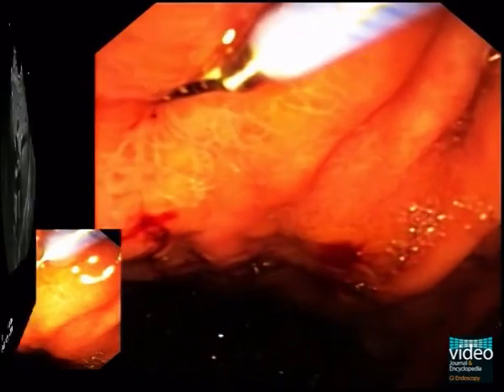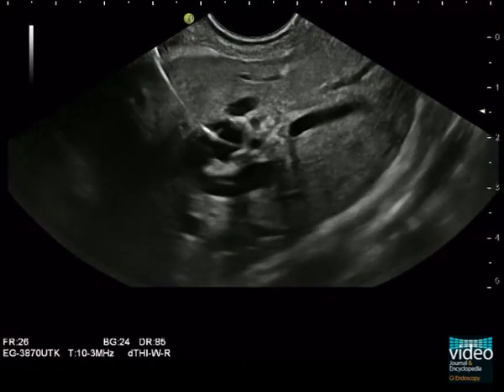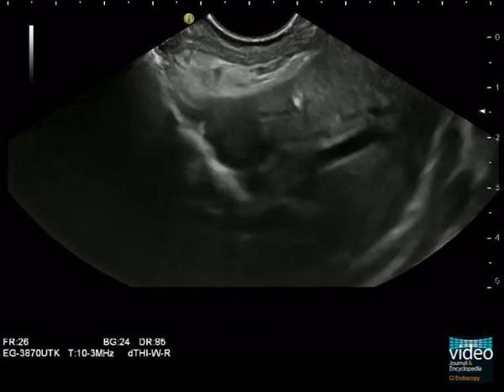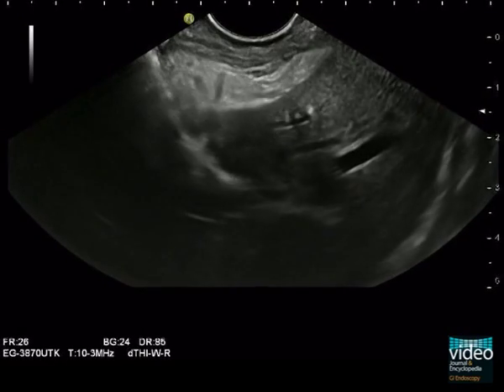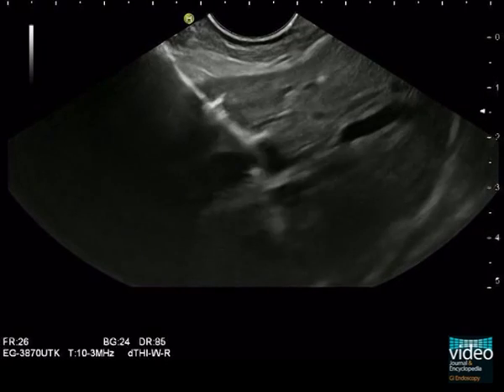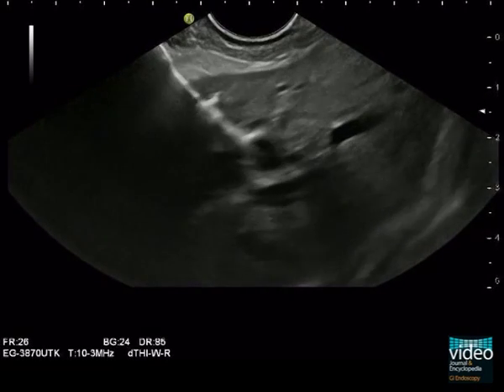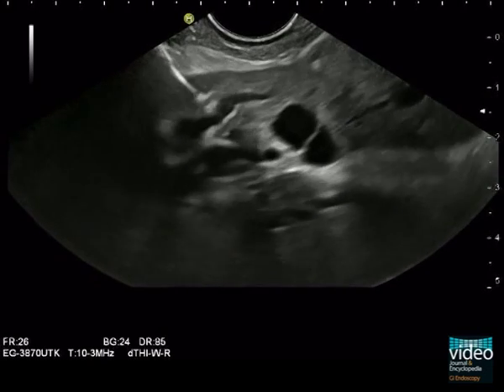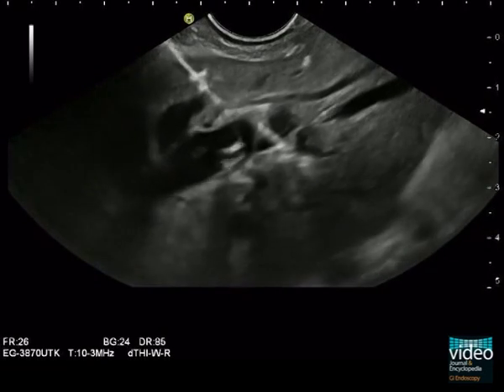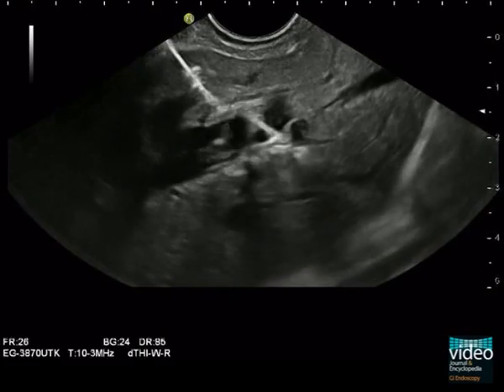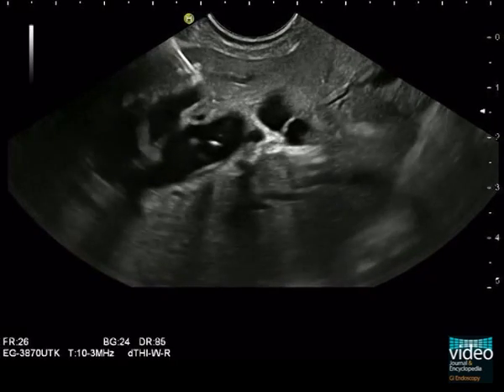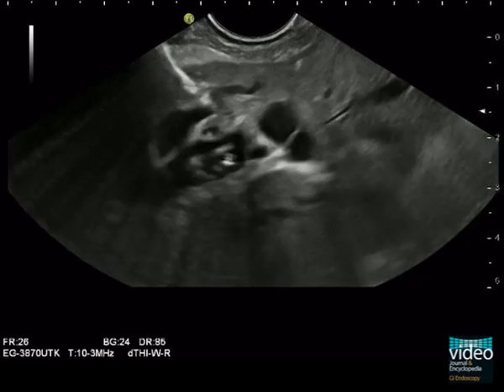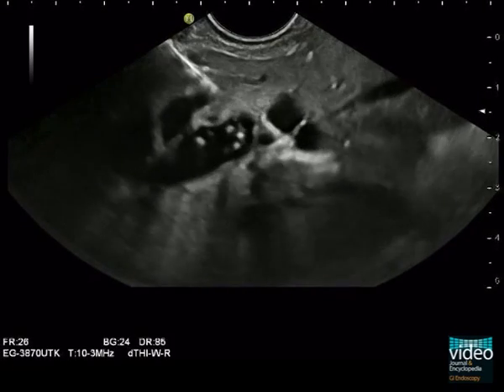Over the guide wire, a high-frequency ring knife is pushed forward up to the gastric wall. Under changing EUS and fluoroscopy control, the motion of the ring knife during high-frequency cauterization is followed. Assessment of hepatic consistency is essential. The ring knife can be moved forward through the hepatic tissue faster or slower. Favouring the slow motion, cauterization should be repeated two or three times to avoid unfavourable dilatation of the former puncture channel prior to stent insertion.